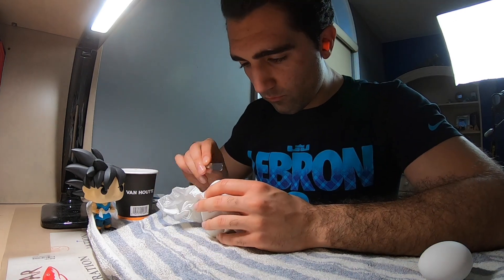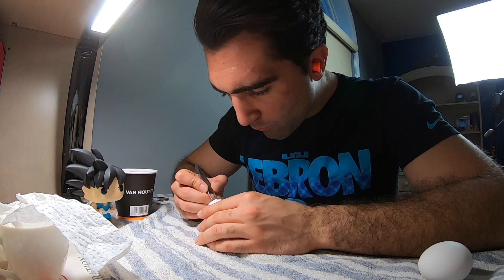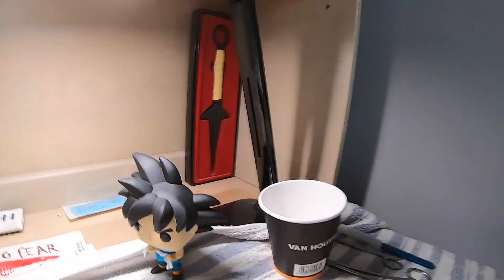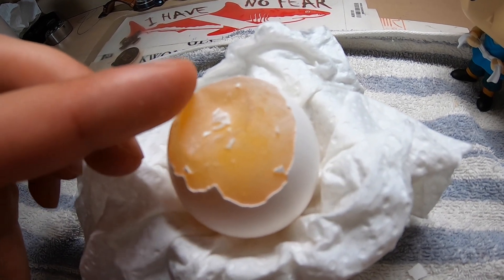I know it looks easy on the big sturdy practice mannequin, but with these very delicate egg membranes it's going to get a lot more complicated. My setup has two eggs — in every transplant you need a donor and a recipient. I'm going to start by prepping the recipient to receive the membrane. That first part was so hard — I had to be so delicate taking off the eggshell pieces without piercing the membrane. The membrane feels kind of like bubble wrap when you touch it lightly. I've prepped the first egg and taken the membrane off the second. The plan is to go in with four bites, one on each side, so when I tip the egg over it doesn't make a mess.